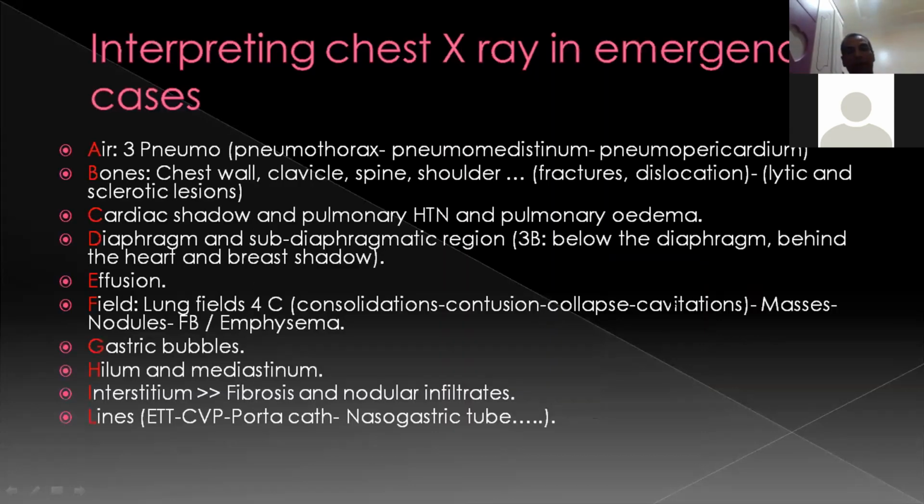We have two different checklists, according to what you like to do, or according to what you like to practice. We have a standard checklist, and this is present on many internet sites and in many locations, starting from A to L. A, regarding pneumo, any air in the chest.